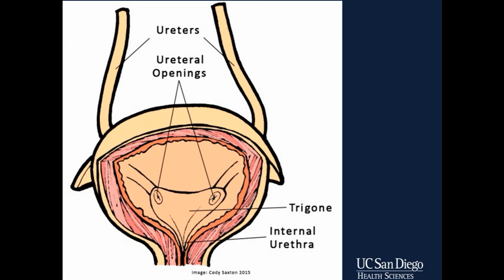Some of the indications for ultrasonography of the urinary bladder include assessing the vesiculo-ureteral junctions and bladder emptying in cases of suspected obstruction, looking for tumors, calculi, foreign body, or diverticulum, and using the full bladder as an acoustic window to assess the prostate in males and gynecologic structures in females.